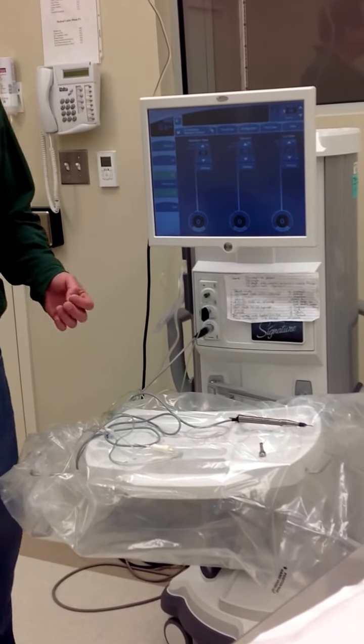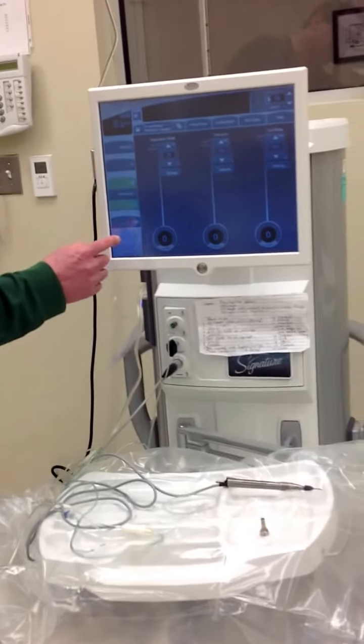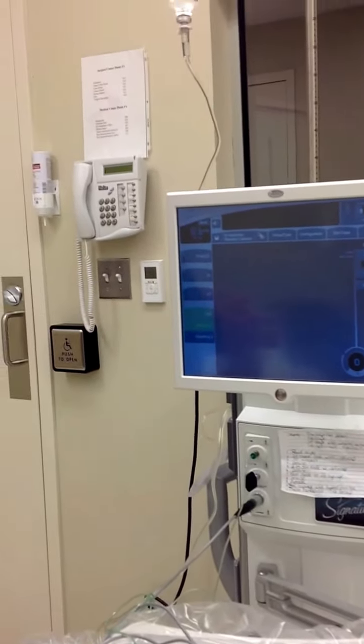The final button on the machine is diathermy. Diathermy 1. Diathermy is another name for cautery. My recollection is Dr. Goodman never uses this. In current surgical practice, very few doctors still do a limbal tunnel, or a scleral tunnel, incision where the cautery is used routinely.